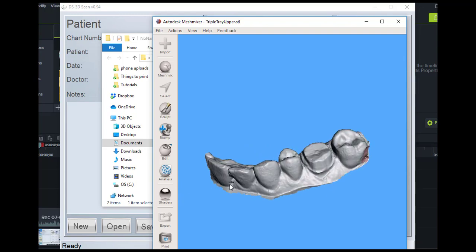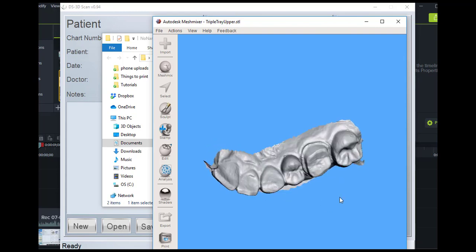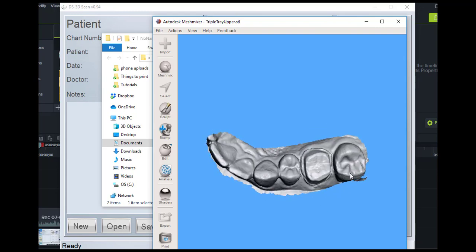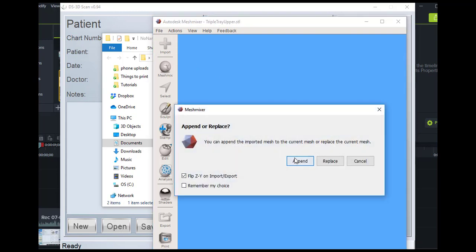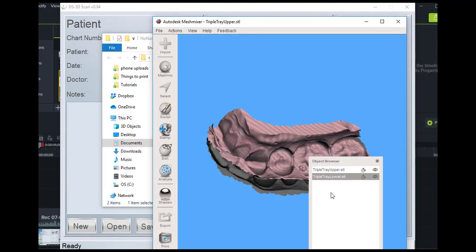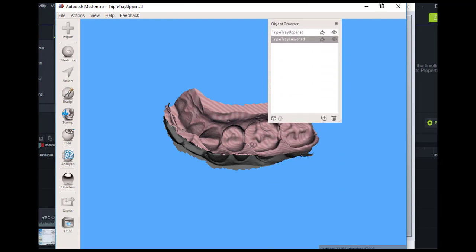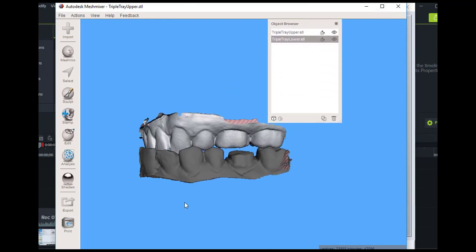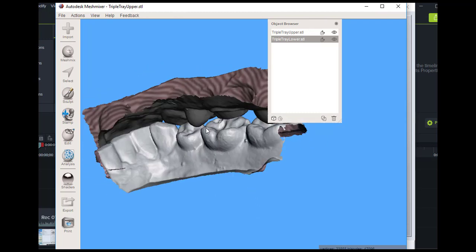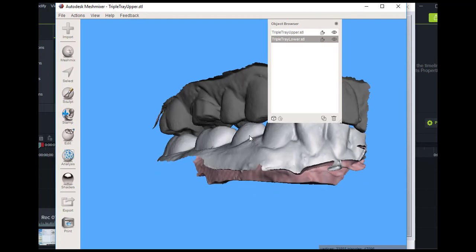There is the maxillary model. You'll note that it has already been reversed. The software does know that it's scanning an impression, so it goes ahead and inverts that model. And append, let's grab the lower to look at it as well. And now you can see both of my models. They're obviously scanned in occlusion. We've got a nice appearance to this.